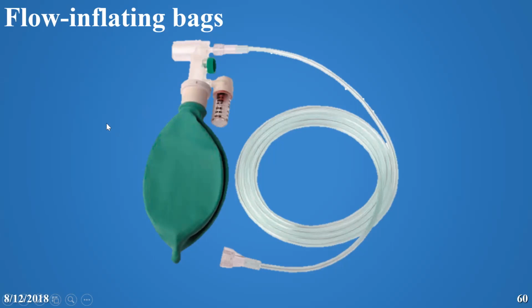Once you start bagging, you can do ventilation. So you can provide 100% oxygen through the flow inflation bag. And if you start to squeeze the bag, you can do ventilation in addition to the oxygen supply. So this mask can give you oxygen supply, but at the same time, like the self-inflation bag, can give you ventilation. Both can give you oxygen and ventilation. However, this needs a flow, and therefore it is only used where there is a wall oxygen and air flow source, and that's why they call it the anesthesia bag.